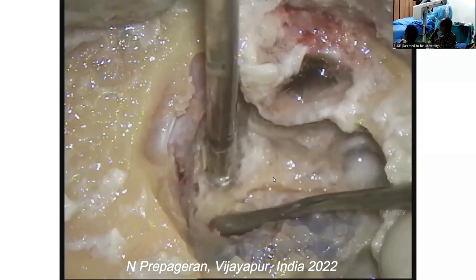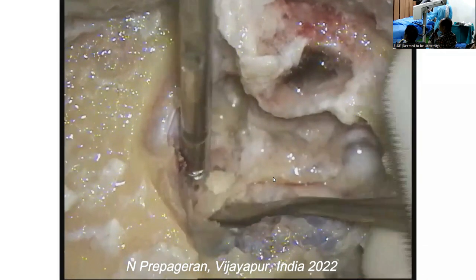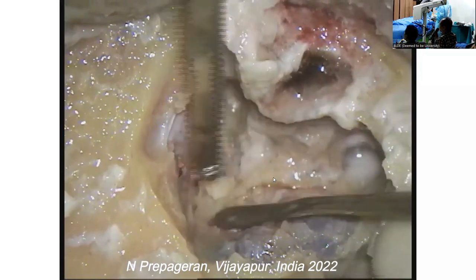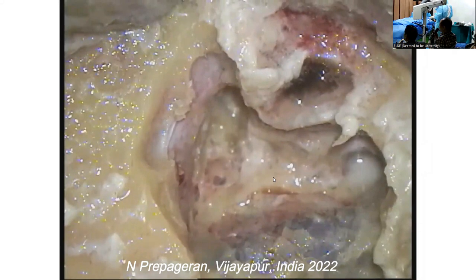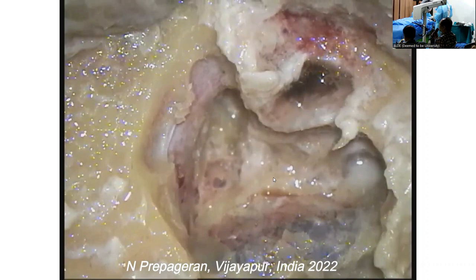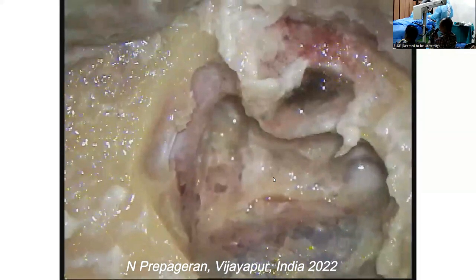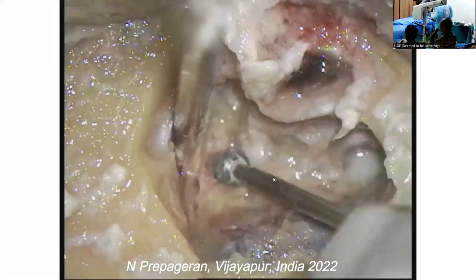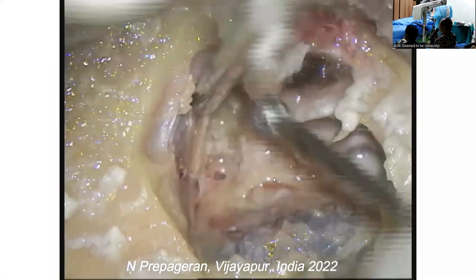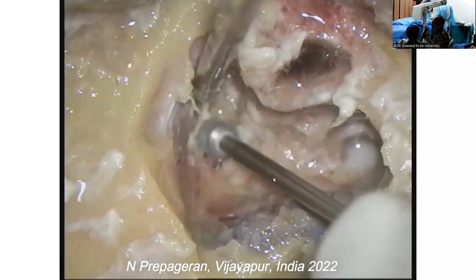posterior cranial fossa, here. Is this Trautmann's triangle? I can't even remember what Trautmann's triangle is. Bounded superiorly by the superior petrosal sinus, posteriorly by the sigmoid sinus, and the labyrinth in front. I just know how to operate and how to give the exposure depending on where the tumor is. Trautmann or no Trautmann.